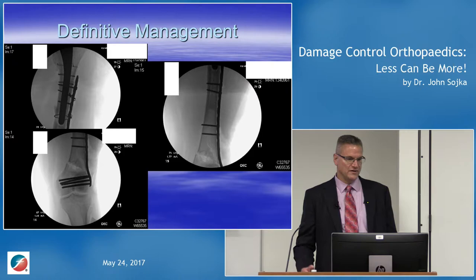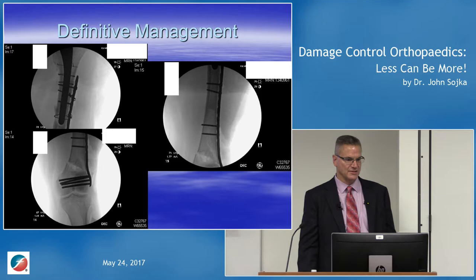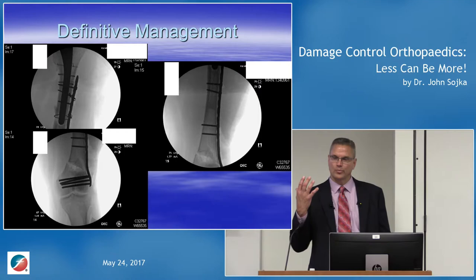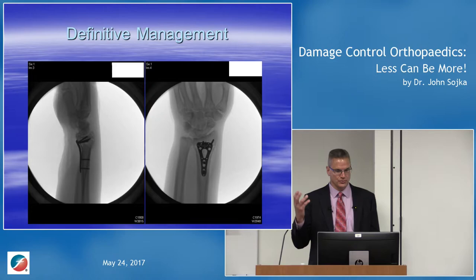And then his definitive fixation was delayed. I think this was probably almost a week and a half out. We did plate fixation of his femur, so you had to deliver that femoral stem back into that intercalary segment. And then we plated that with a long plate and put femoral strut allograft above that region as an additional brace, if you will, to the anterior portion, and then got a nice reduction down at the distal portion. And then way later, two or three days later, I brought him back when he was still more stable to plate his distal radius fracture.